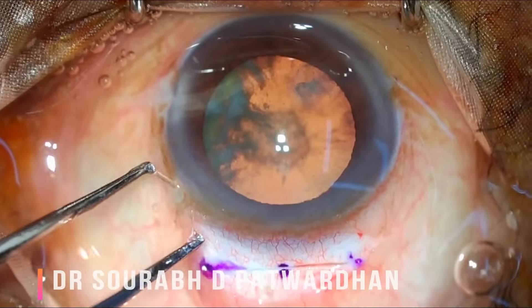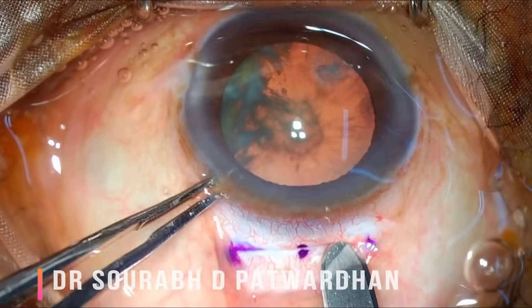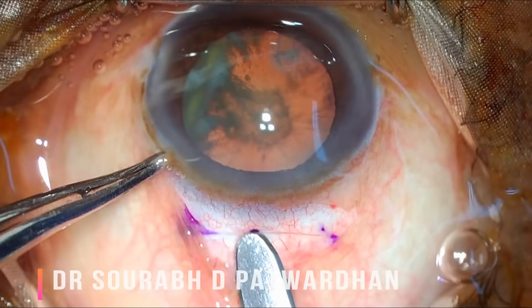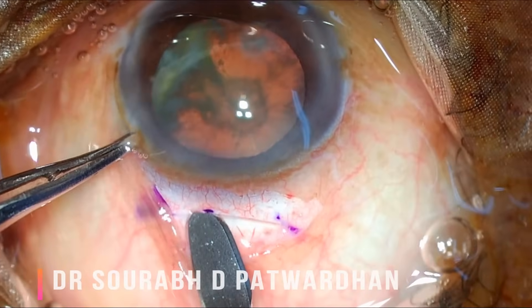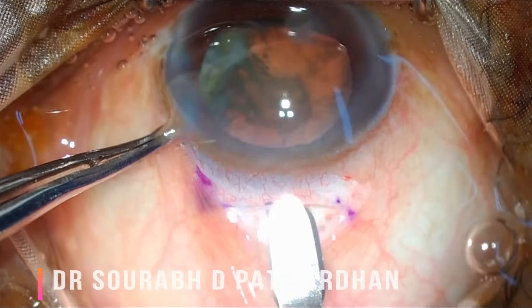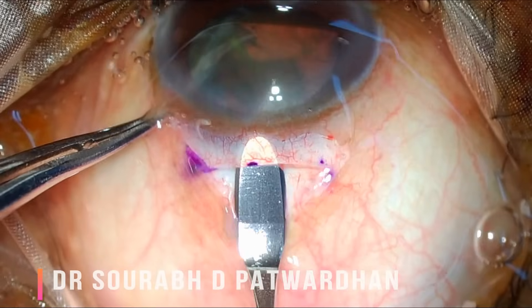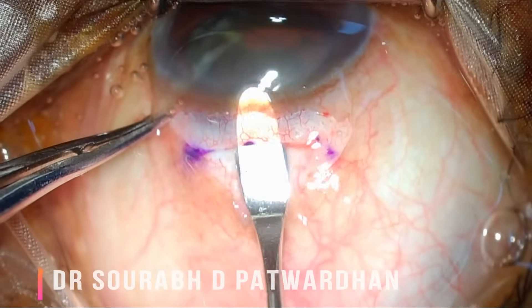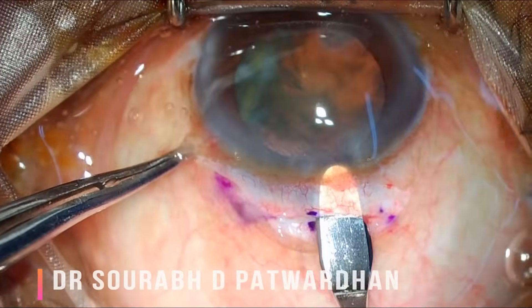Now I am using a crescent blade to make a deep groove joining these three points. The groove should be around 200 to 300 microns in depth. Once the groove is made, I very gently start dissecting the sclera. Making the incision at the right depth is the most important part. Go very slowly; see to it that the crescent is still seen through the sclera but not very clearly seen — that means you are at the right depth.